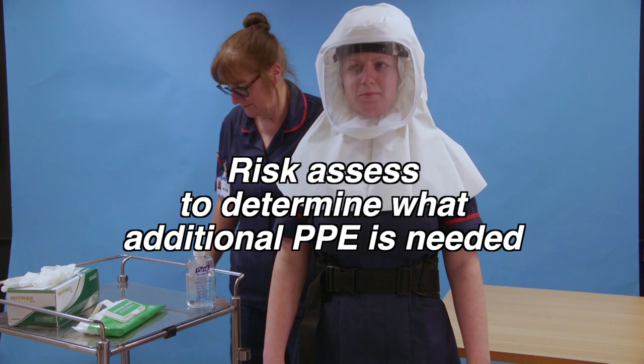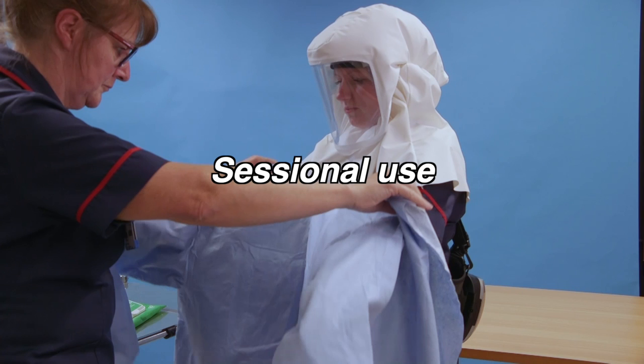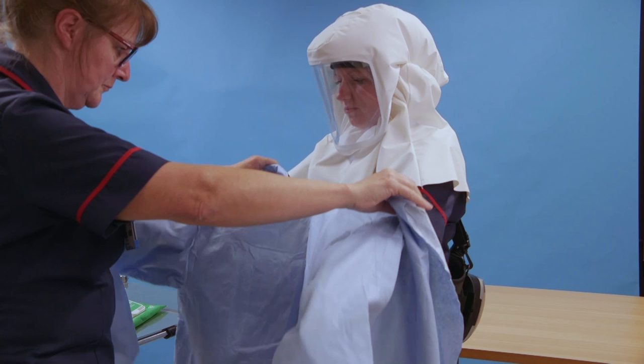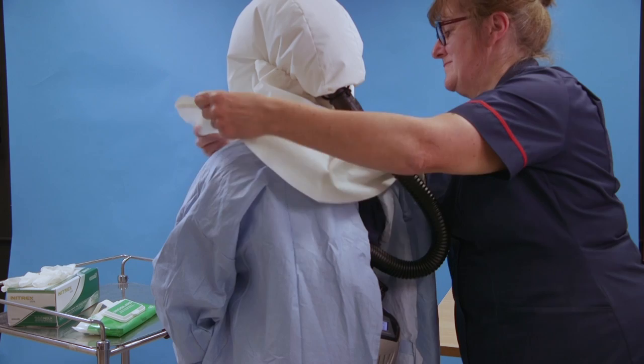This video shows how to put on a long sleeve gown when wearing the Perso respirator. It also shows how an apron and gloves can be worn on top for an individual patient. When the long sleeve gown is being worn for sessional use, always remember to remove your gloves and apron and clean your hands after each patient contact. Put on the long sleeve gown. Your buddy ties it at the back of the neck and around the waist, ensuring the respirator is not obstructed.